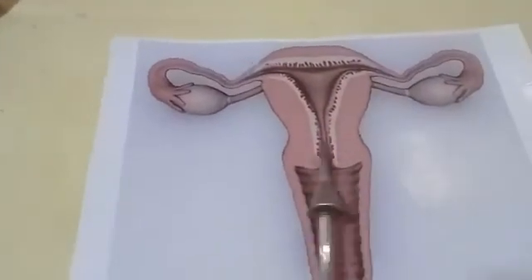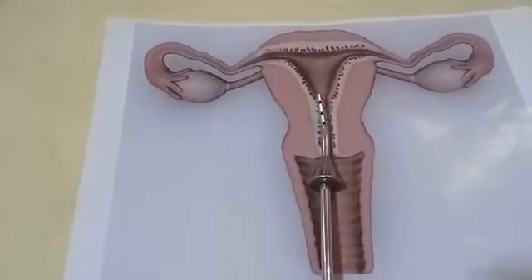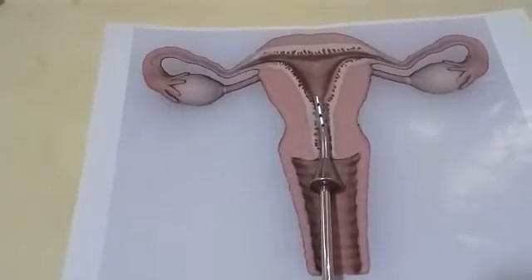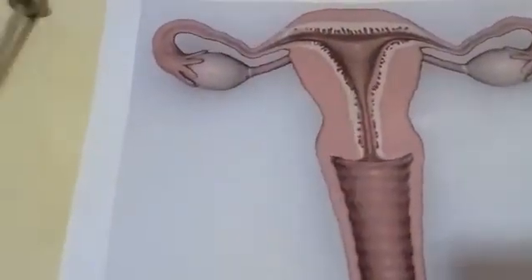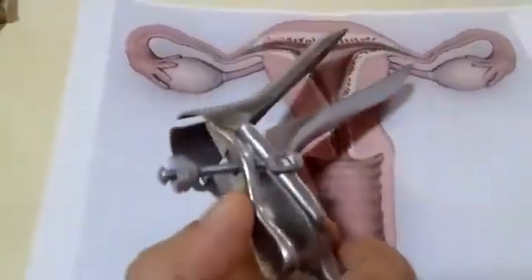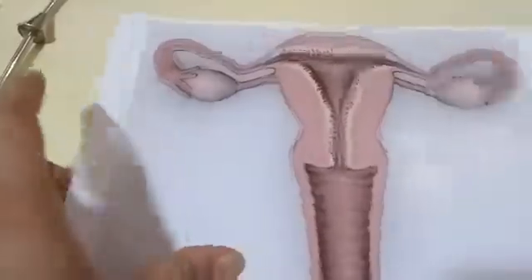You introduce the cannula through the cervix, then inject dye inside the uterine cavity, followed by X-ray films — one immediate and one delayed. To open the vagina, you use the Cusco speculum, then inject the dye using the olive insufflation cannula.